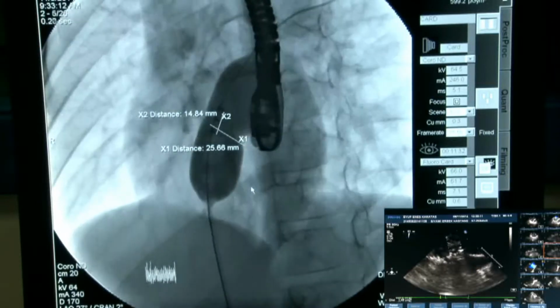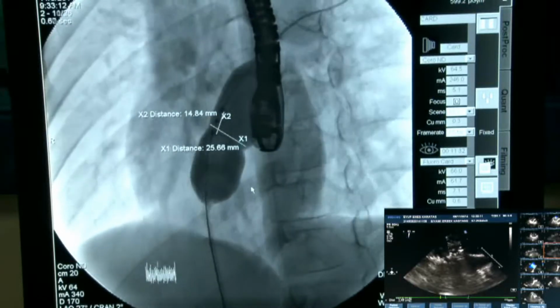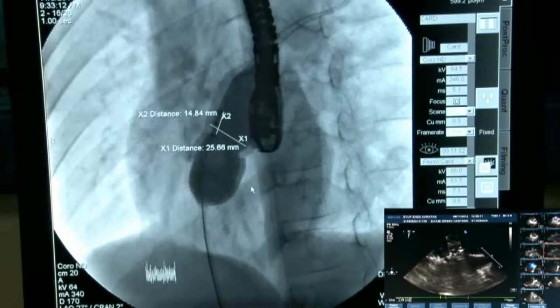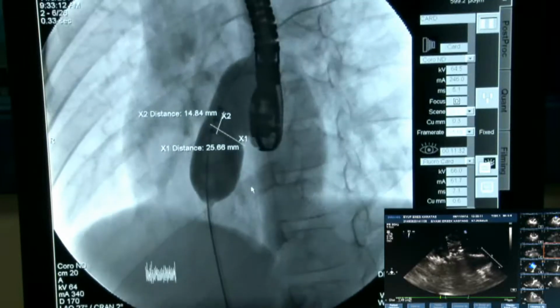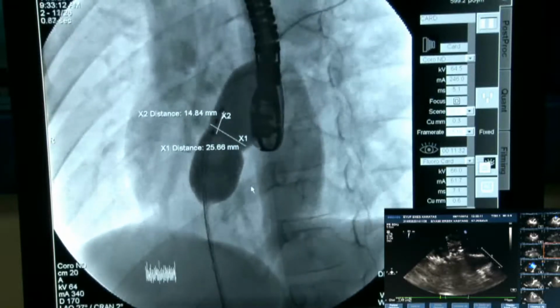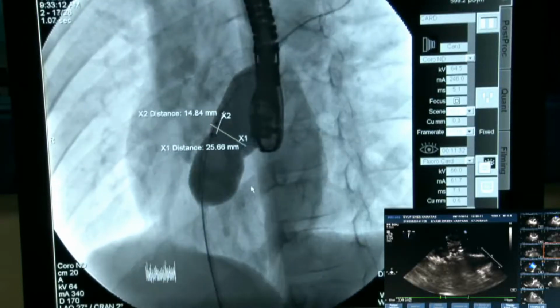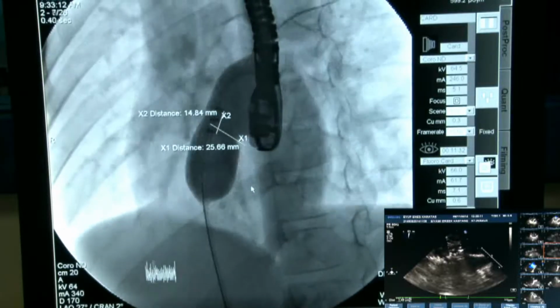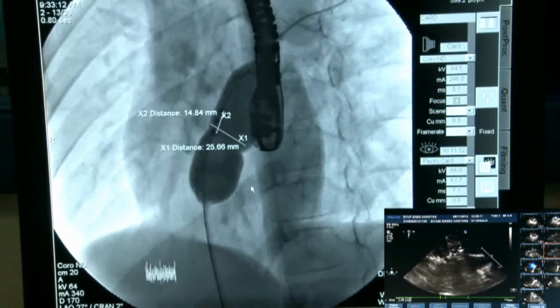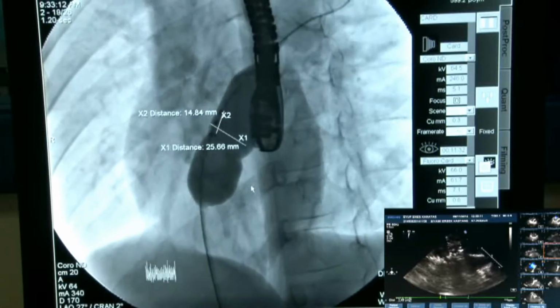The patient's total septum measures about 32 to 35 millimeters, and the defect stretch size is about 16. Stop flow size is about 15 millimeters. So, what do you think the size of the occluder? Then why did you select 16? Well, the stretch size is 16, but with the stop flow technique it's about 15 on echo. Then why a 16 size device? Why not 15? We are just asking what size device you would use. Which do you prefer, 16? I would use 15.